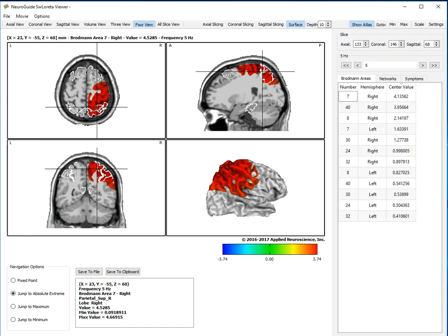And Neuroguide looks at the magnitude of the z-scores, rank orders them, and lists the z-scores of greatest value.